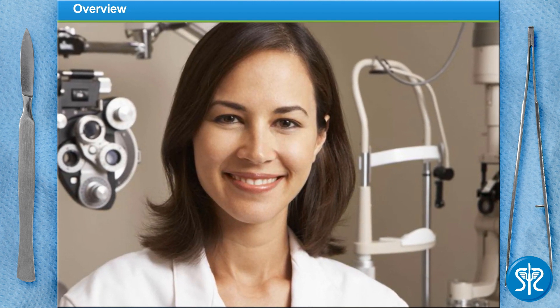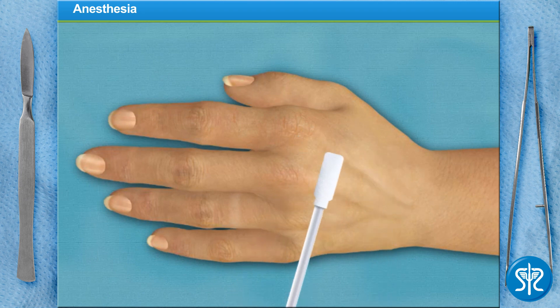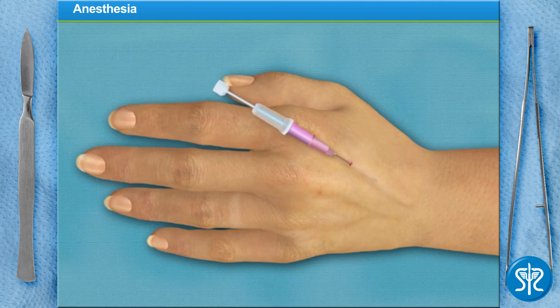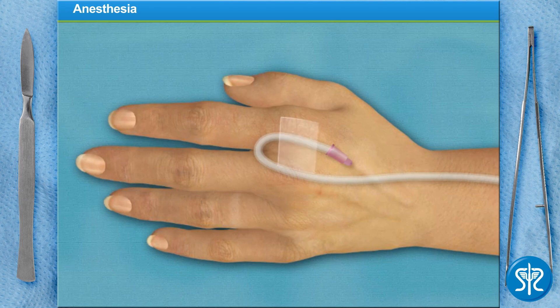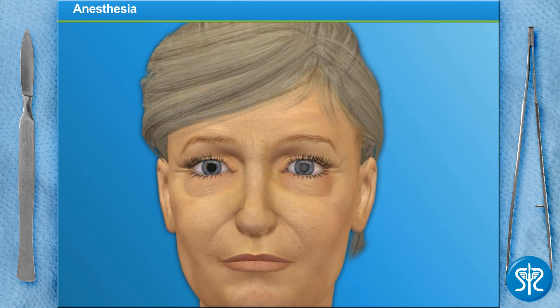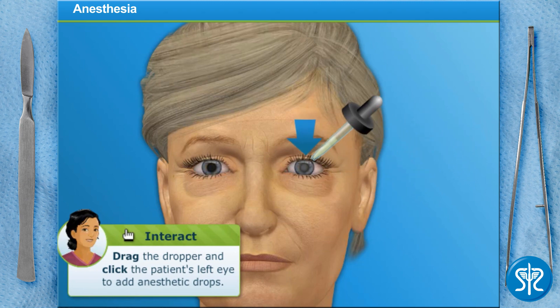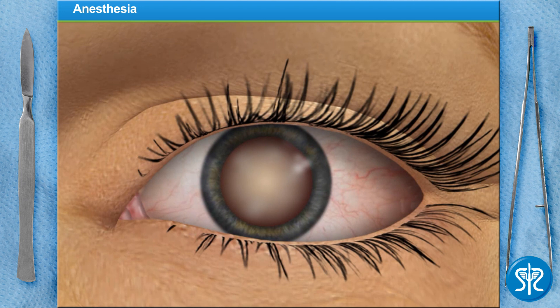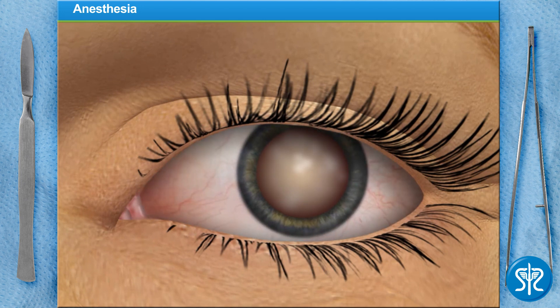Let's begin. First, we need to administer a relaxing sedative intravenously. This will make our patient drowsy, but not put her to sleep. Just prior to surgery, additional drops of anesthetic are applied. We'll use a device called a speculum to hold the eye open wide during the procedure.